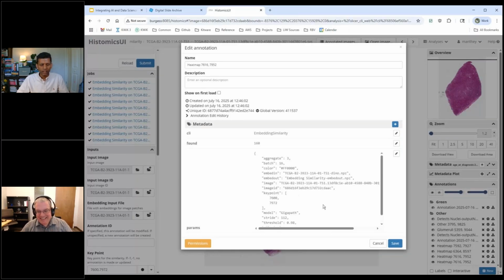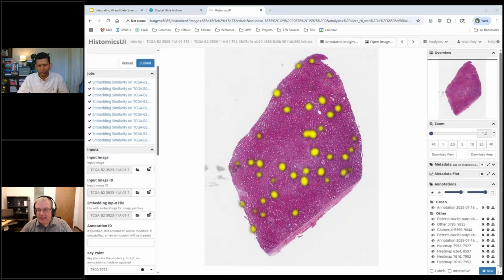So, David, there's one more question. I don't think we got into it earlier. The question was, did we talk about conversion from vendor-specific format to DICOM? Yeah.